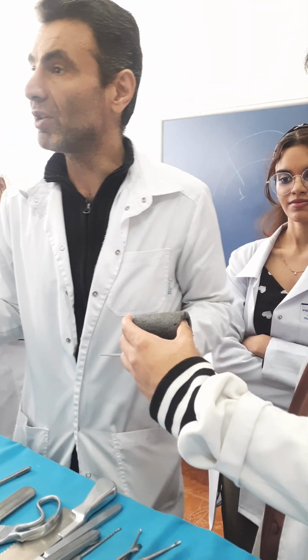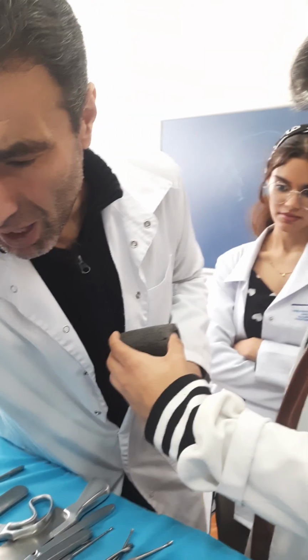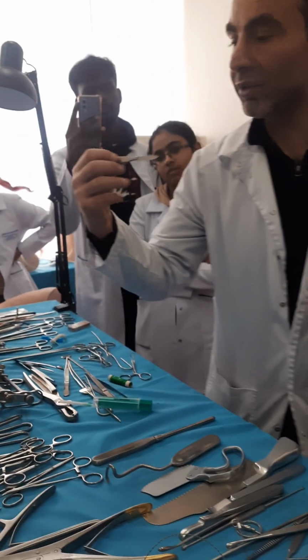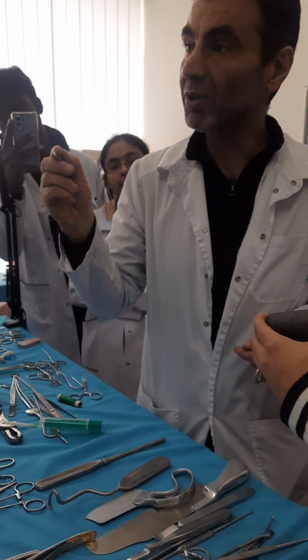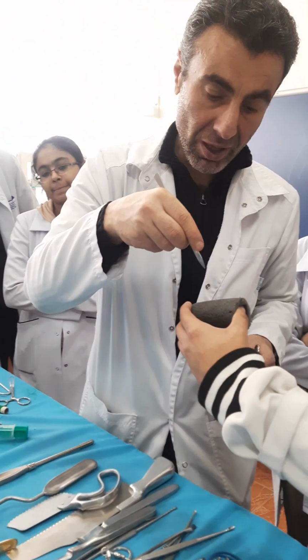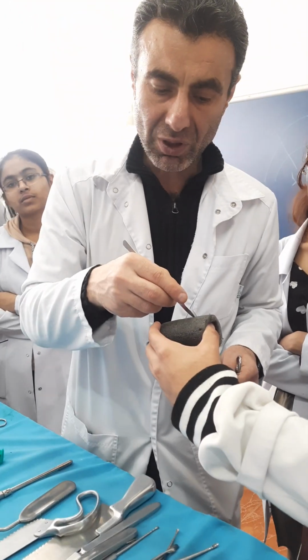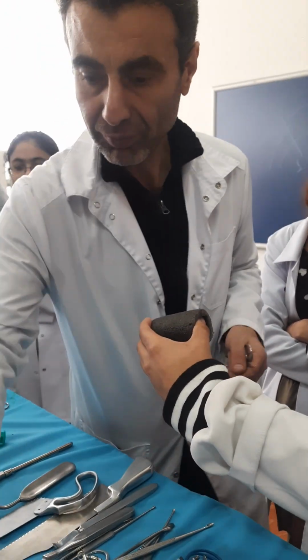There are easier ways to kill the patient. So don't do it. What after this? After this, you take this sharp-pointed scalpel, you remember, in the pen gripping position, and very important, separate approximately 1 centimeter of the blade to not perforate the posterior wall. And by a piercing movement, you perforate it. Approximately, you cut 1 or 2 bodies of the cartilages. It is more than enough.